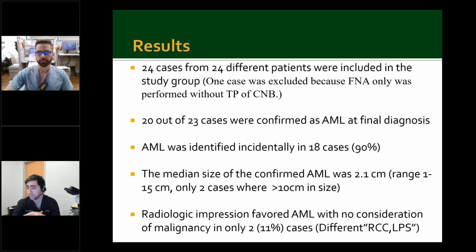So the study included a total of 24 cases from 24 different patients, with 20 cases, mostly from females, being confirmed as angiomyolipoma at the final diagnosis. And only one case was excluded because FNA only was performed without the touch prep. The median age of the patients was around 65 years.